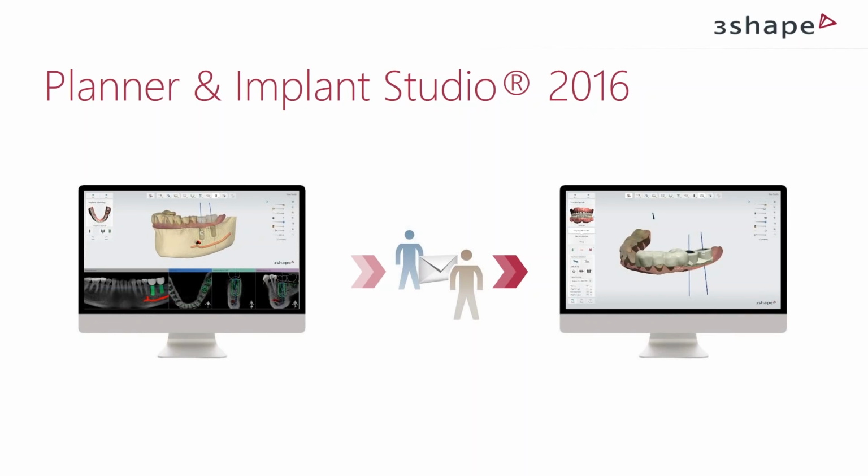This is to involve the dentists, not for everybody, because everybody doesn't want to do this planning and so on, but we have the possibility. But again, it's a key behavior of 3Shape products. We are adapting and we are allowing workflows which suit your preference, but also your needs in your daily work. You can focus on the part you feel strong and confident about, like planning as a clinician, but also leave the specialty work like a guide design to the lab technician.